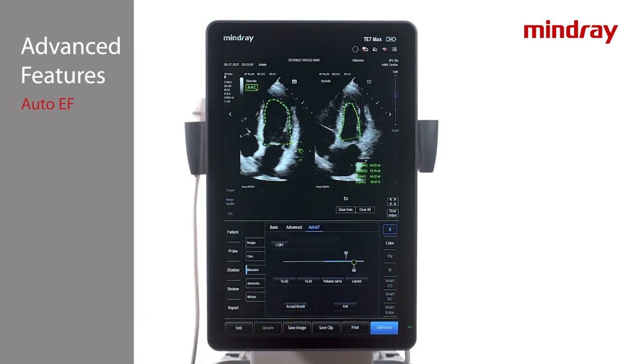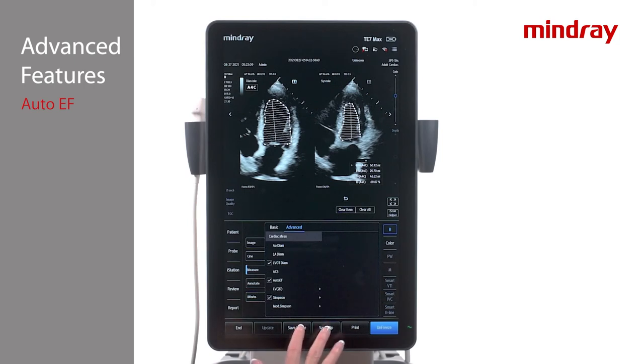Underneath the image there are additional control options. Accept Results will put the data into the report. Hitting the Save tab along the bottom will both save an image of the screen and put the data into a report. If desired, repeat the process with the other view. Analysis of both apical 4 chamber and apical 2 chamber views will yield biplane results.